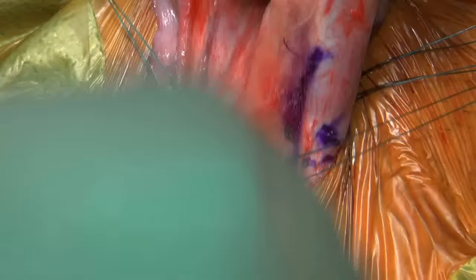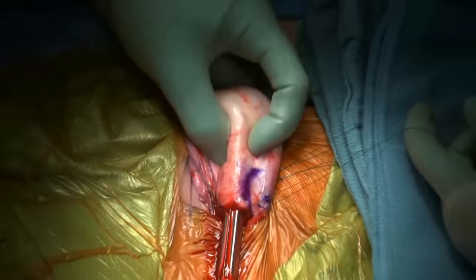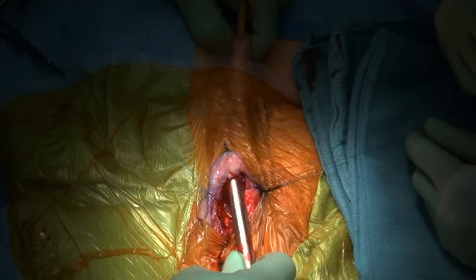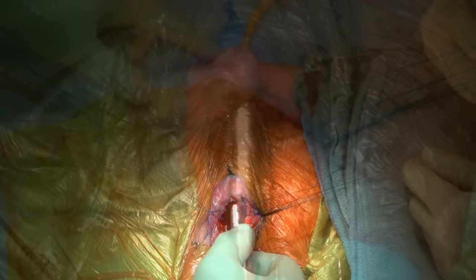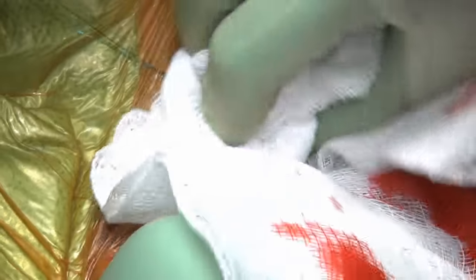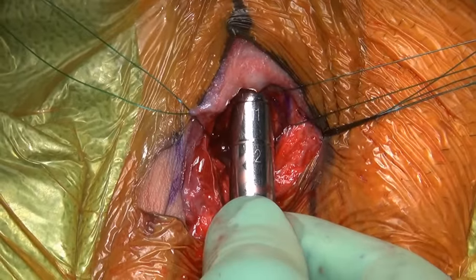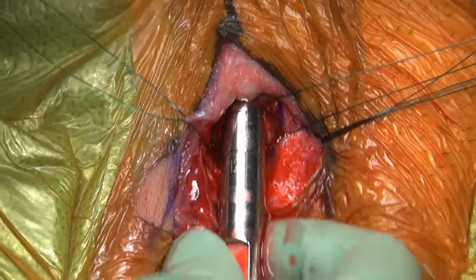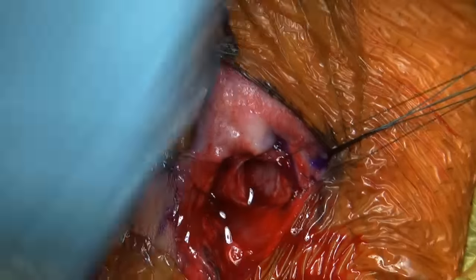I now pull out and change the trajectory of the dilator toward the distal corpora. I angle the dilator laterally toward the ipsilateral shoulder. With a rotational motion, I advance the dilator to beneath the glans penis. Again, we measure from the dilator. Right distal measurement is 12 cm. We measured proximally 9 and distally 12 for a total measurement of 21 cm. These steps are repeated on the contralateral side.